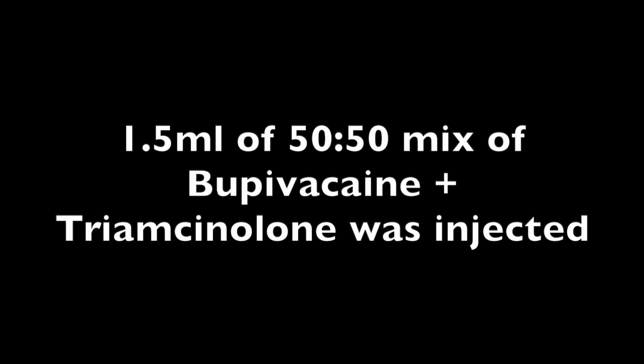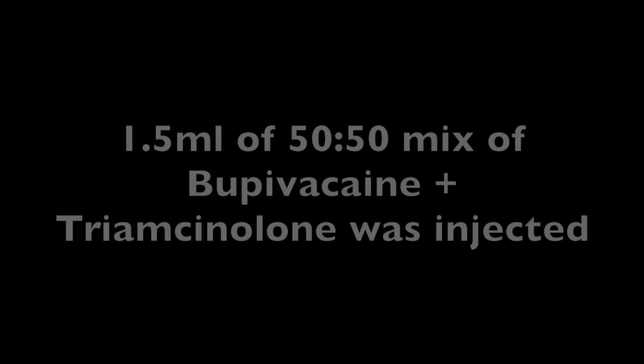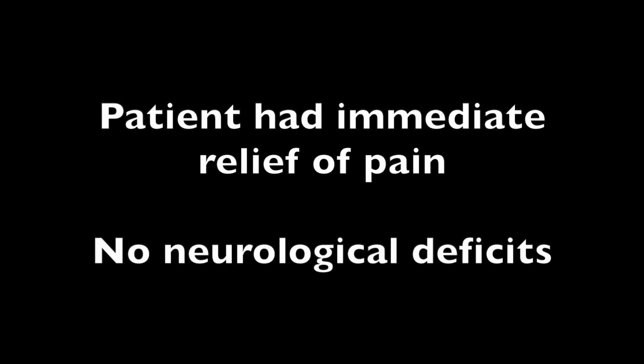A 1.5 ml mixture containing equal parts of bupivacaine and triamcinolone was injected after careful aspiration. The patient experienced immediate pain relief with no neurological deficits.